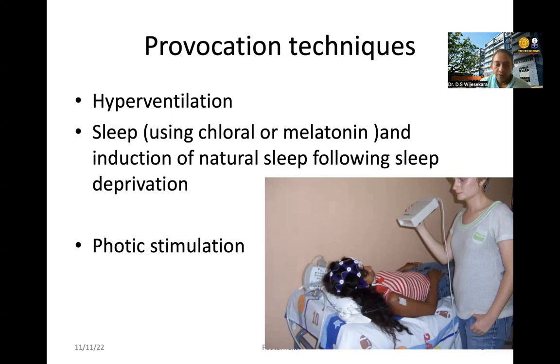And then the photic stimulation, that is you focus light, which is at different frequencies, to the child's eye. So this is what this technician is doing. She focuses the light flashes onto the child's eye.